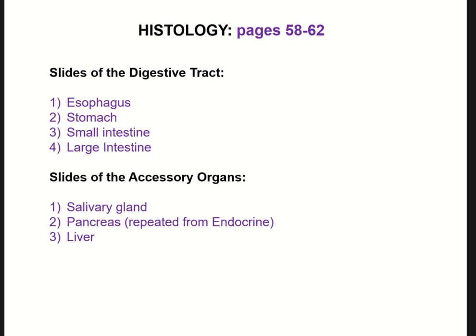I am going to try to record again the video for going over histology of the digestive system with you, and hopefully I'll be able to keep it as short as I can. But I wanted to review with you what sort of things we want to be looking at when it comes to histology. And for those of you who are going to be following along with your lab manuals, it's going to be over pages 58, 59, 60, 61, and a little bit of 62 in your lab manuals.